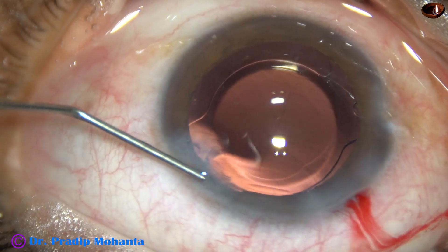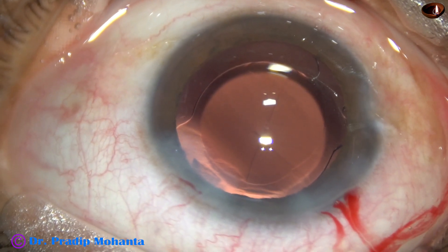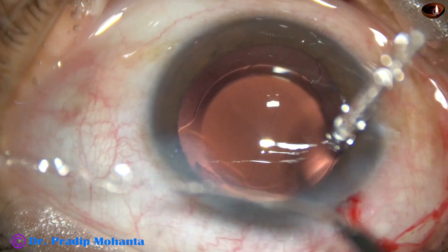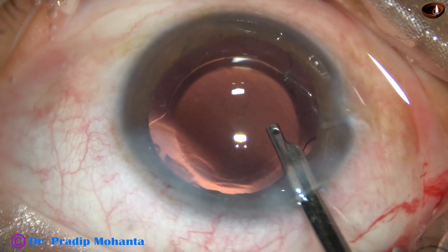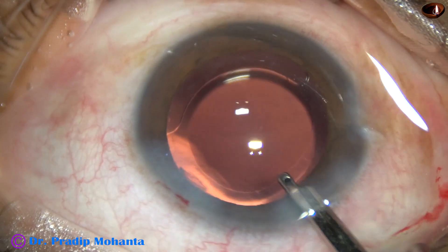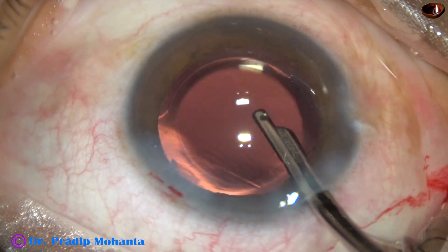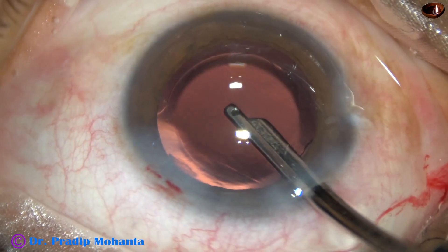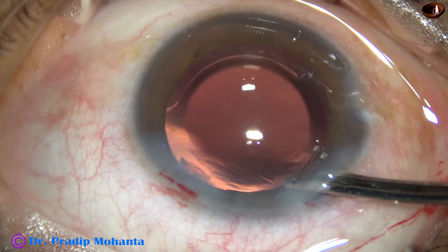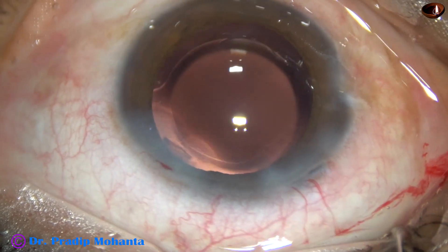The single side port made in this case is closed by corneal stromal hydration. This is the final lavage of the anterior chamber — a gentle stream of BSS is directed towards the corneal endothelium, and the BSS dislodges material from the corneal endothelium and removes it through the main wound. The chamber is then formed nicely and the case is concluded.